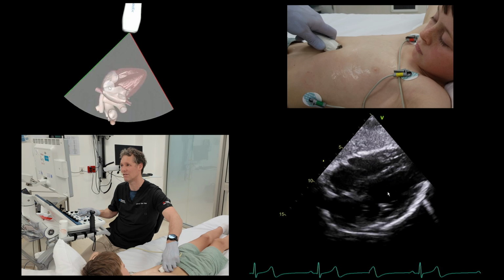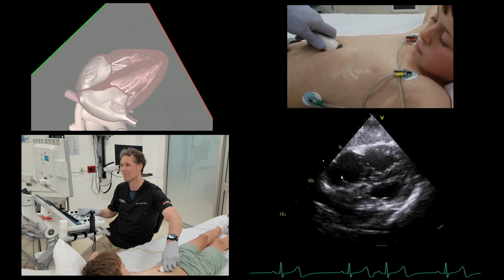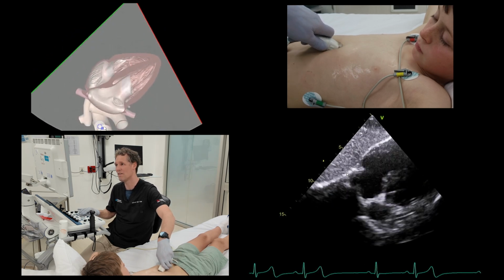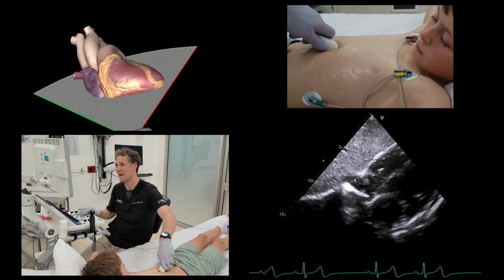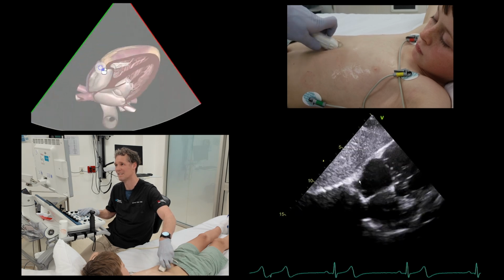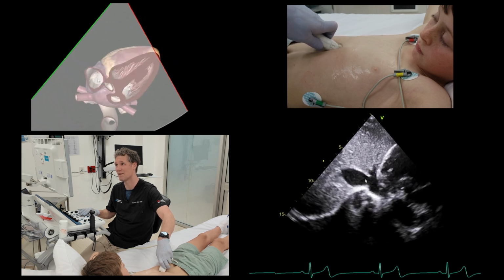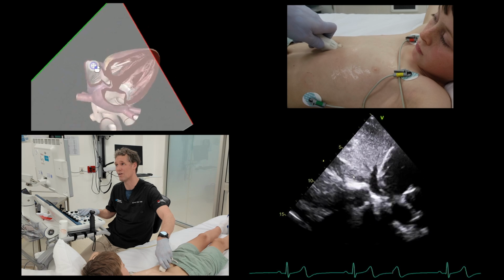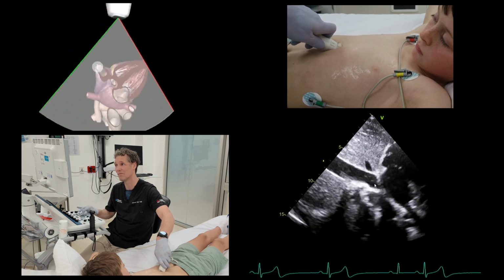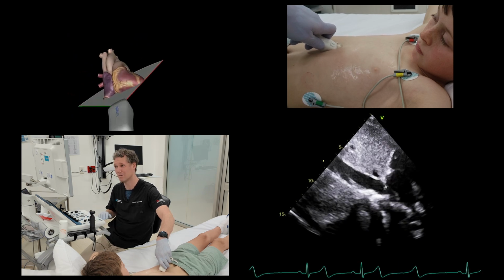Left atrium, left ventricle, right atrium. To look for the IVC, I bring the border where the IVC might be coming in and I just fan upwards and downwards. So I start seeing that IVC entering that right atrium. I keep that in the middle of the screen and I rotate round until it looks long and thin and enters into the right atrium. Yeah? I do the same thing every single time.